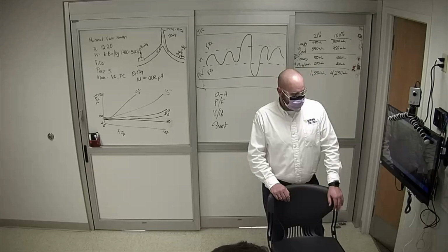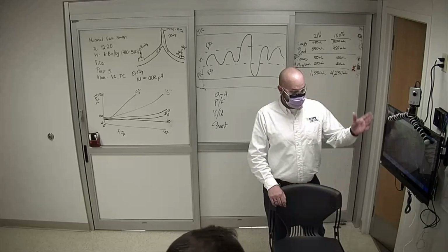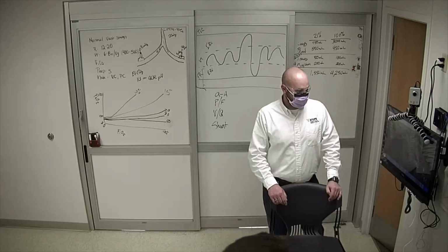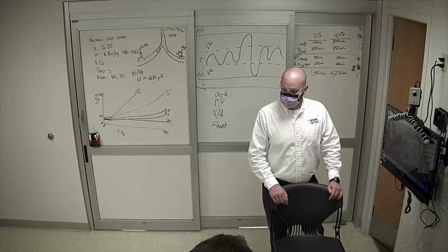First thing I would think is maybe try to suction the ET tube to see if there's a blockage. You got elevated peak pressure. I like your thought process here. Got a little hypoxia, got elevated peak pressure. Except one thing doesn't fit. One of these things is not like the other. What doesn't fit? CVP. It went up. Explain that.